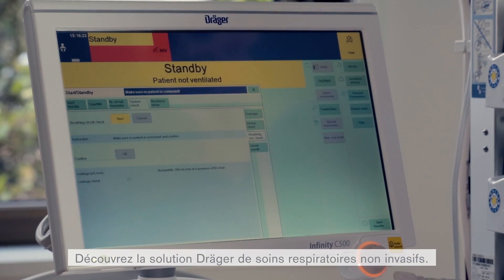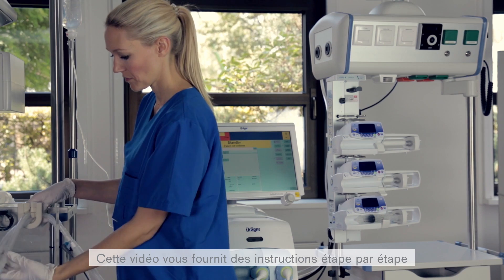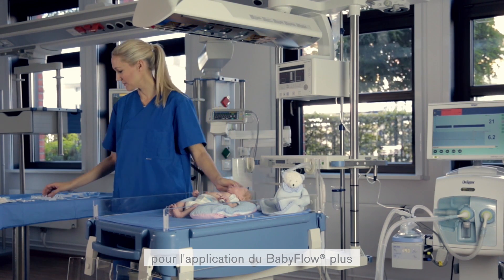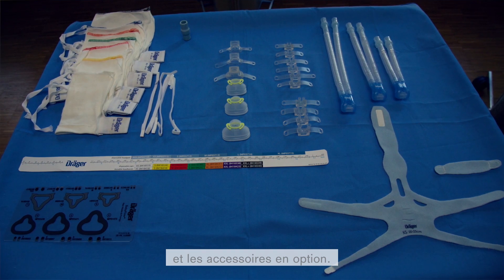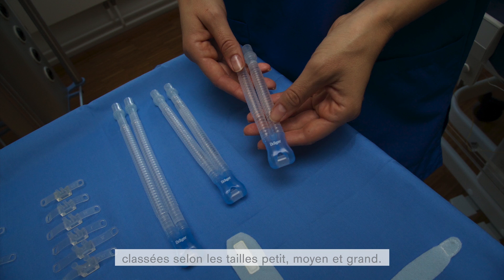Welcome to the Draeger solution for non-invasive respiratory care. In this video, we will demonstrate the step-by-step instructions for the application of the Baby Flow Plus and all relevant accessory options. The Baby Flow Plus is available in three different lengths which are classified as sizes small, medium, and large.